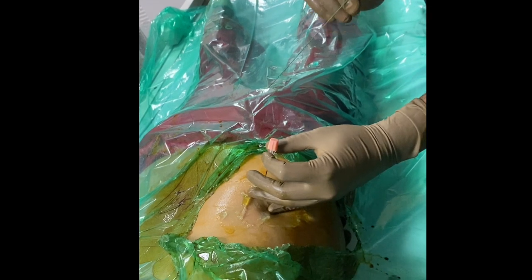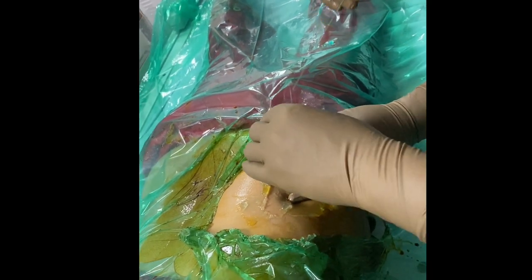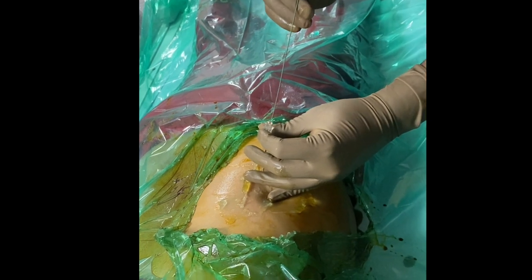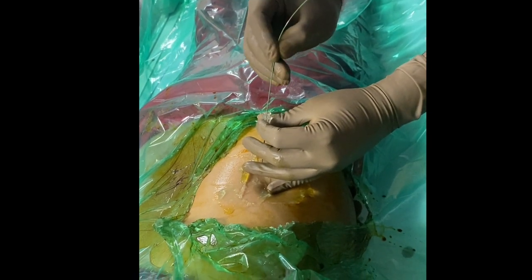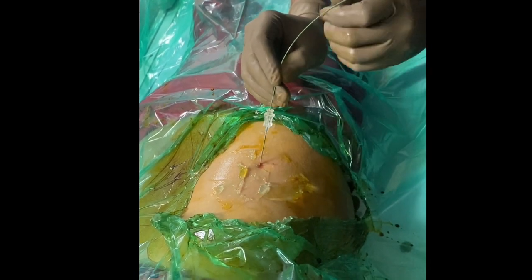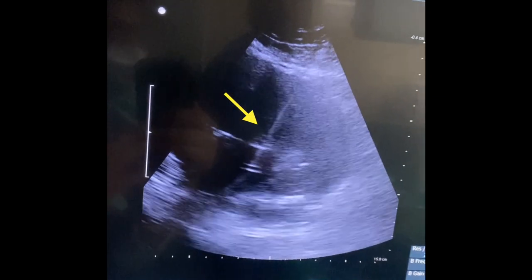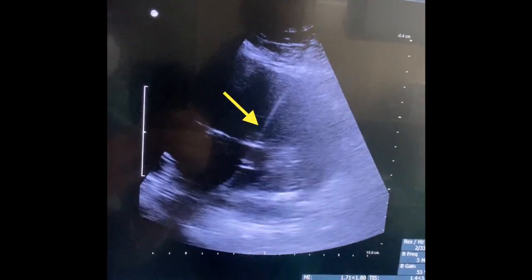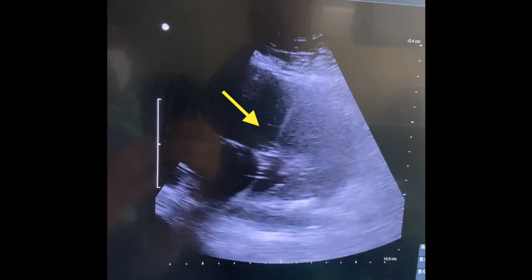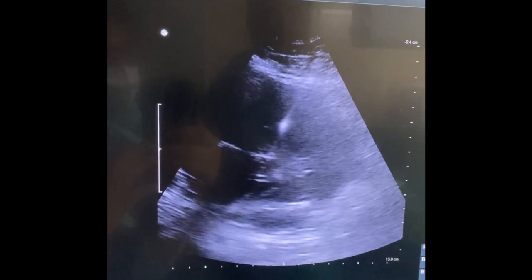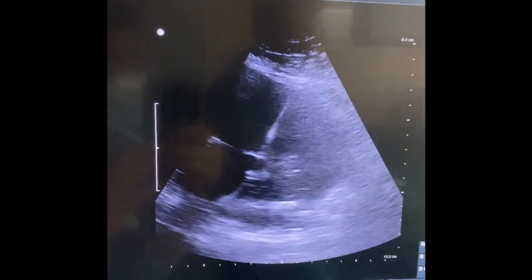After confirming needle position, the needle is stabilized and an assistant removes the stylet. Clear reflux of urine is seen coming out through the needle, confirming intrarenal position. A super-stiff guide wire is then passed into the needle, and under ultrasound guidance, the entry of the guide wire into the collecting system can be tracked clearly.